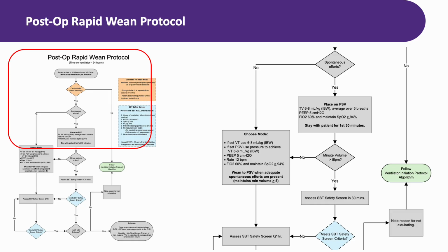Both pathways converge towards the same goal: ventilator liberation. One may just get there faster than the other, depending on the patient's respiratory status upon arrival. The protocol accommodates both scenarios, and your job is to identify which pathway applies and follow it accordingly.